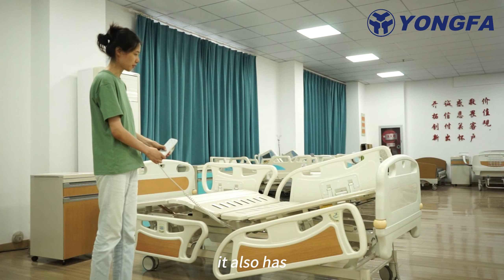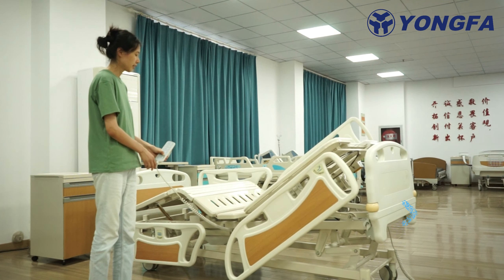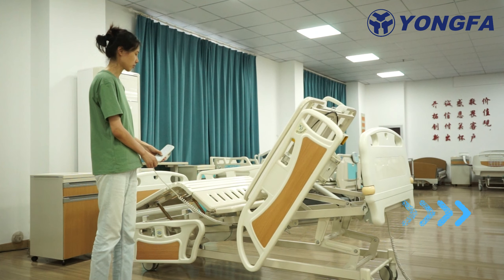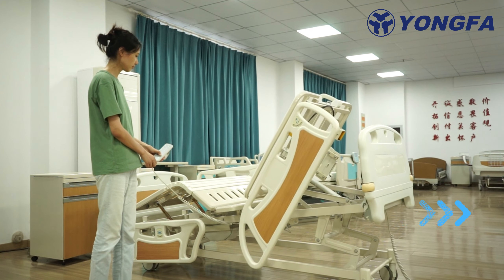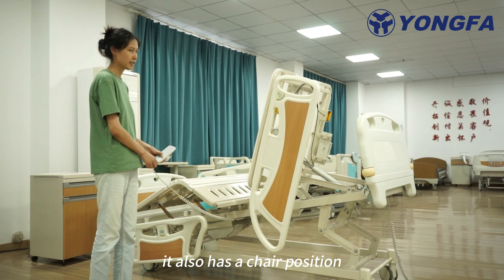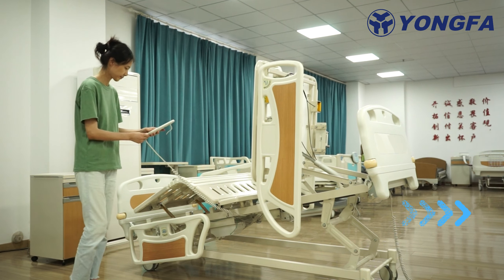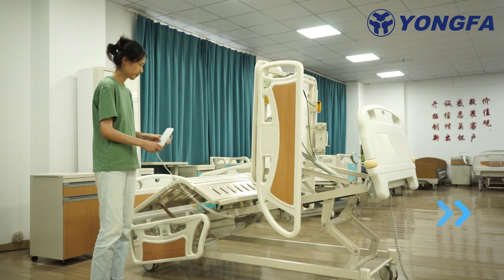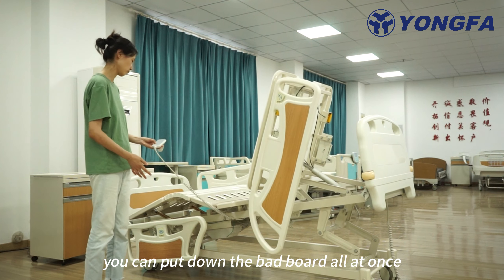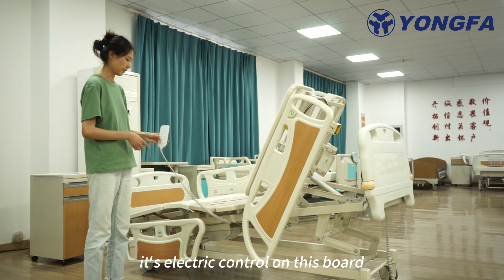It also has a chair position. You can put down the positions. You can put down the bed board all at once with the CPR function. It's electric control of this board.